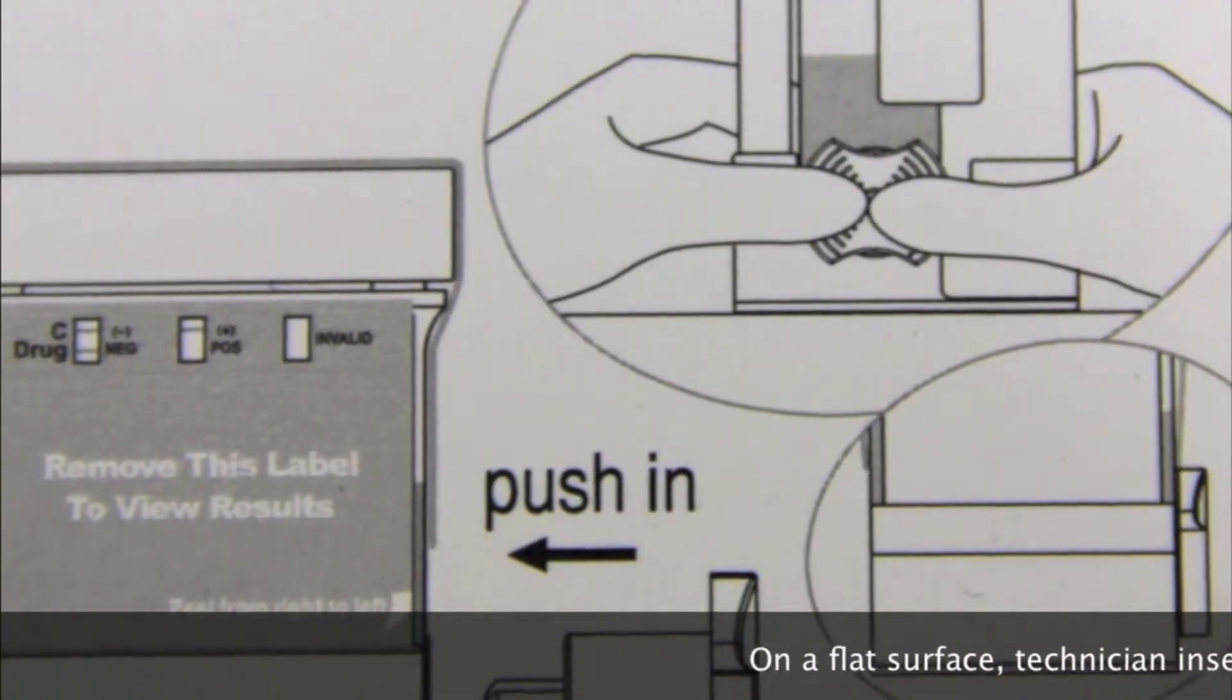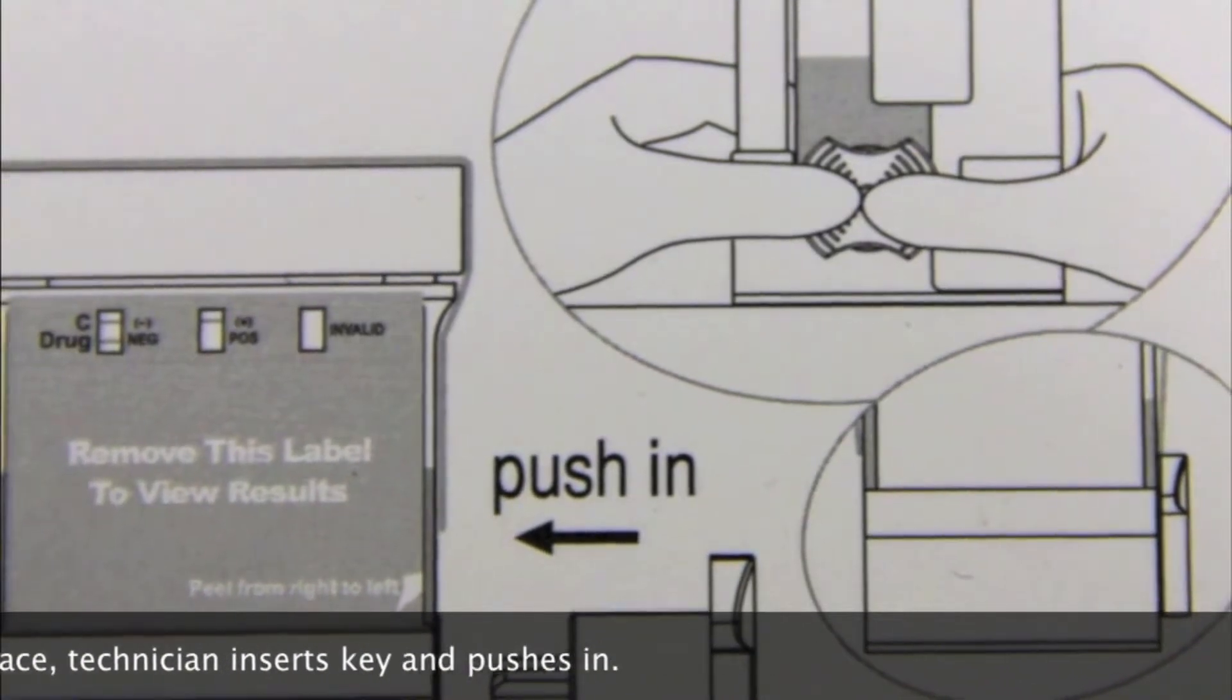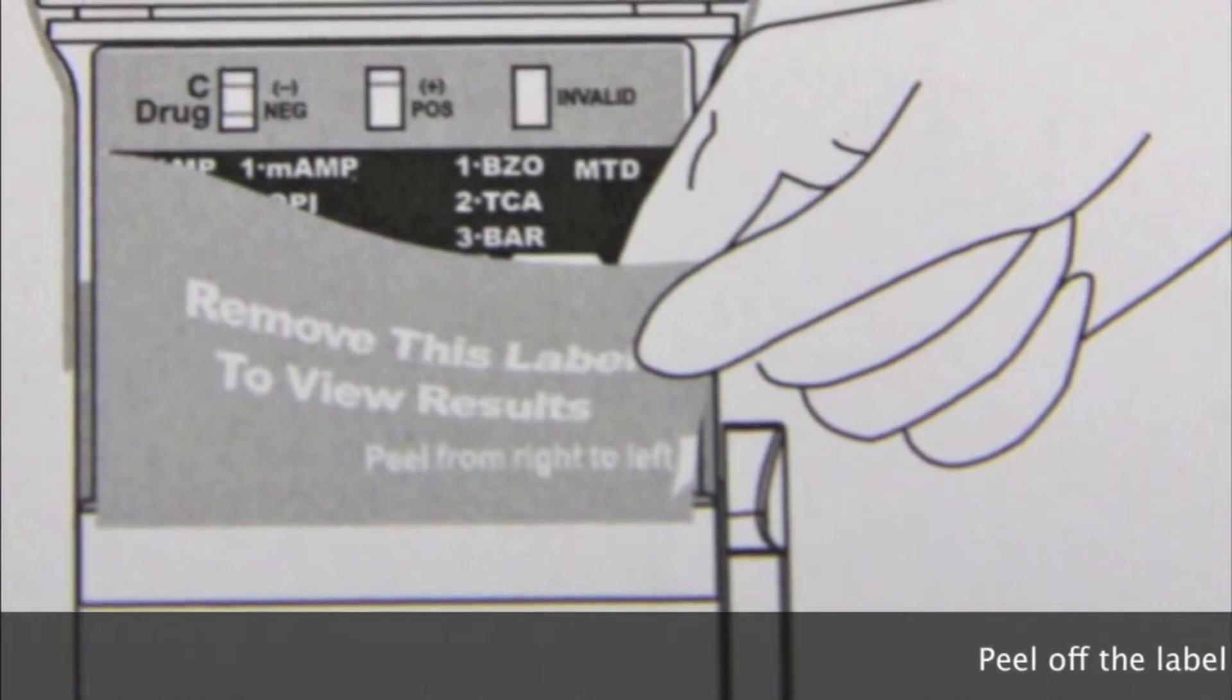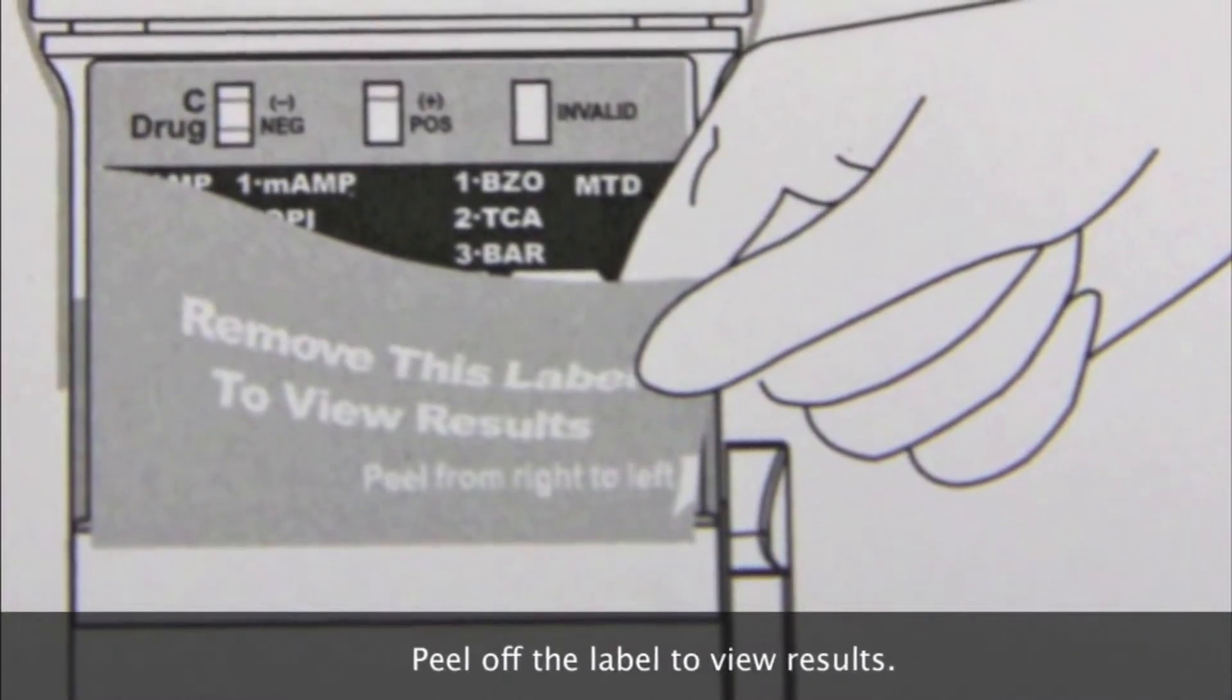On a flat, steady surface, the technician inserts the key and pushes inward. Be sure to peel off the label on the front of the test to reveal the results.